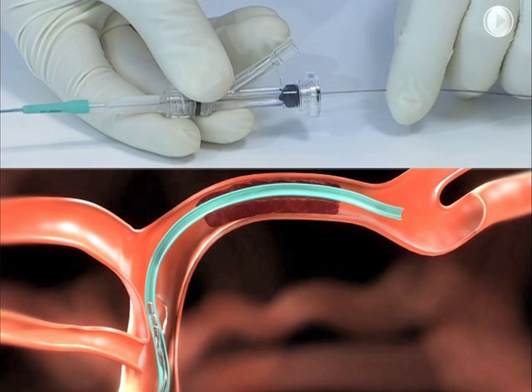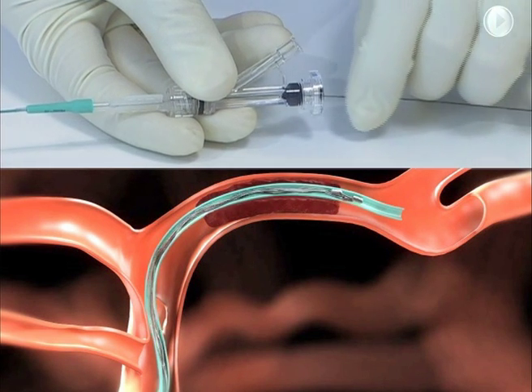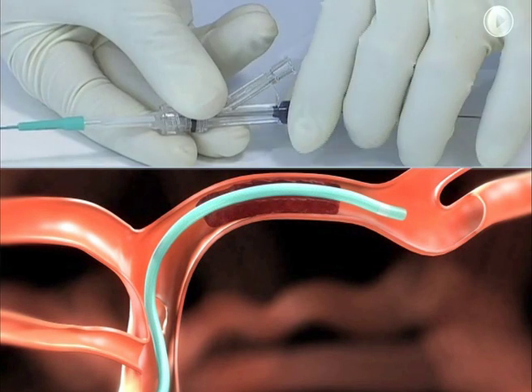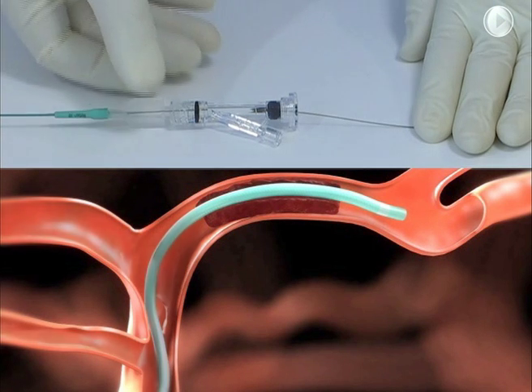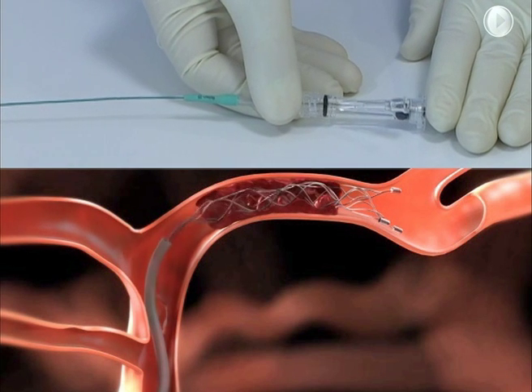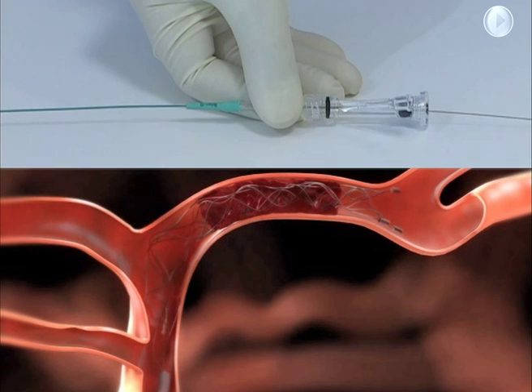With the aid of fluoroscopic imaging, carefully advance the Solitaire FR until its distal markers line up at the end of the micro catheter. To deploy the Solitaire FR, loosen the RHV. Then carefully withdraw the micro catheter while holding the Solitaire FR in place until the micro catheter tip covers only the proximal marker of the device.